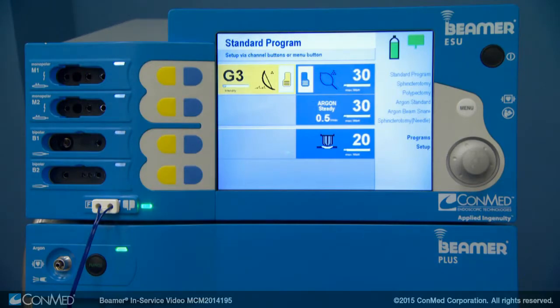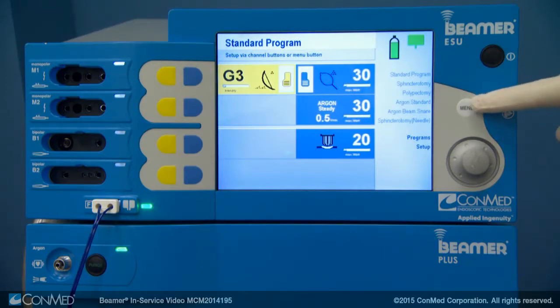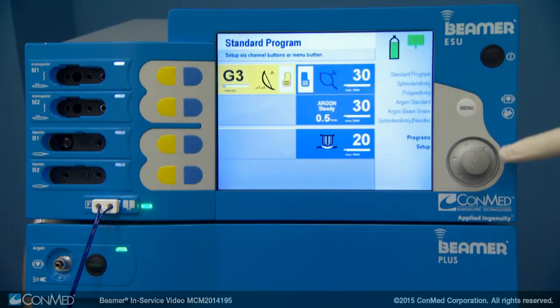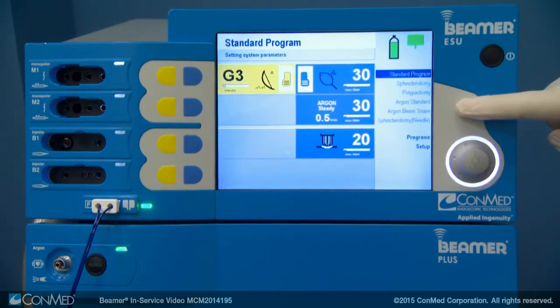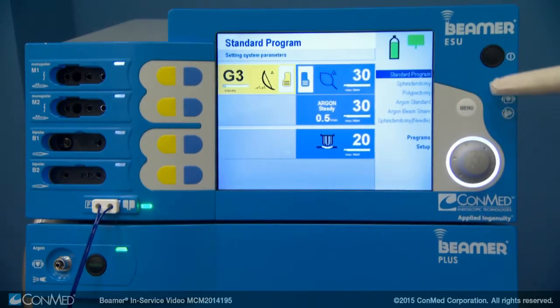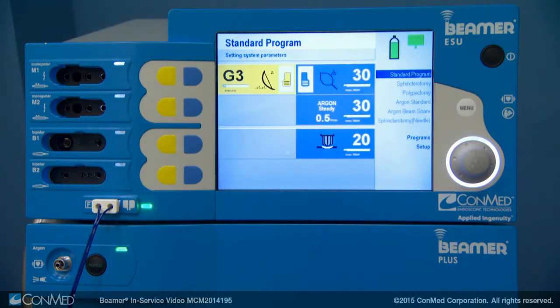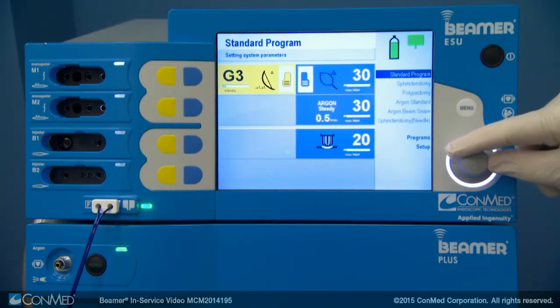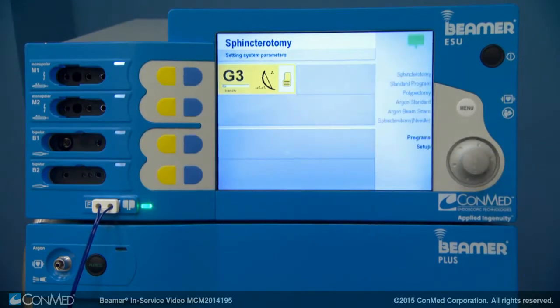To the right of the screen are the two main buttons you will use to operate the system. The first is the menu button and the second is the rotary switch. When pressed, the menu button allows you to access the list of programs on screen by highlighting a cursor. Use the rotary switch to scroll to the desired selection and when there, simply press the switch, which activates that highlighted mode.